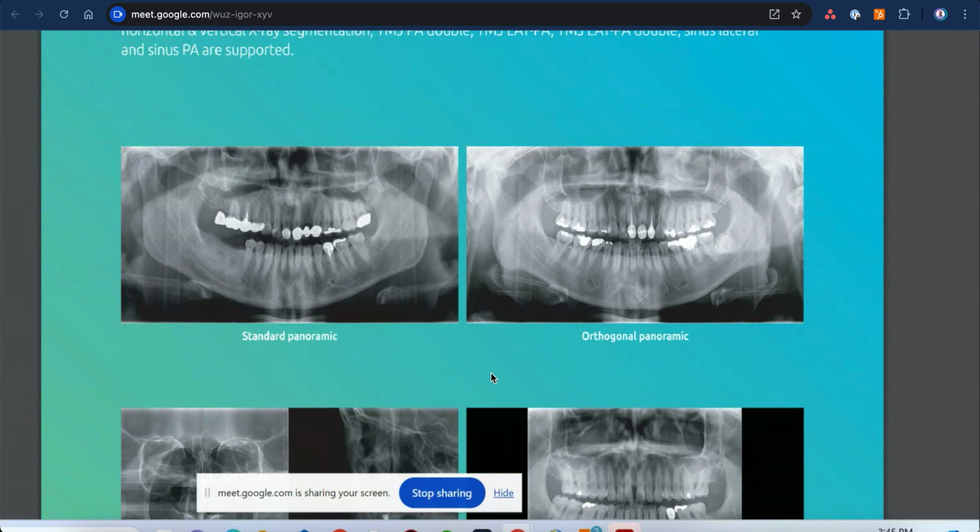Okay, this is the one. Can you see the mouse? Yes, we can. This is where the patient puts his chin, so I can take the photos. And these two are so the patient can make his head still so it doesn't move. And this one, the patient can hold in his hand so he doesn't move.